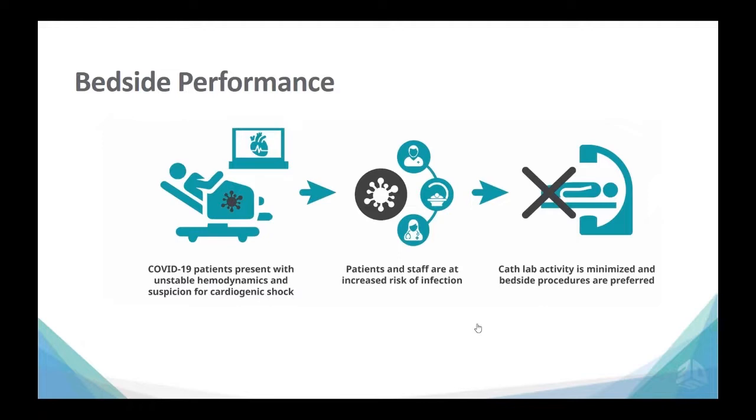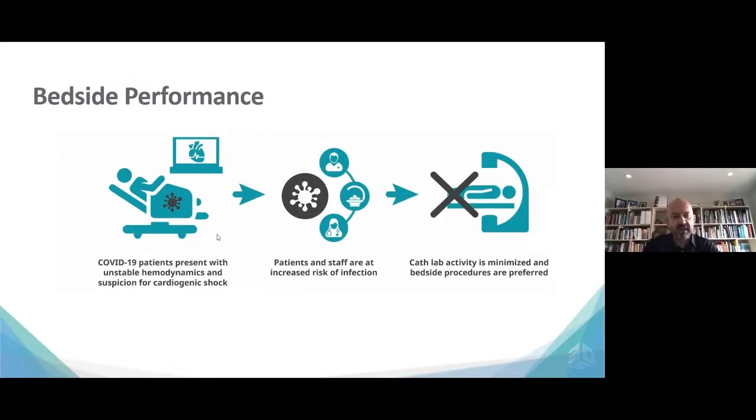So it's really interesting how we've come full circle, because right heart catheterization, or how it's also called PA catheterization, and then colloquially people sometimes call it Swan-Ganz catheter placement. We used to do it at bedside a lot because this was the standard way of doing this. And then over time, the procedure moved over to the cath lab, just because we became more comfortable doing this with fluoroscopy. But nowadays, we have to rethink the old way of doing things.